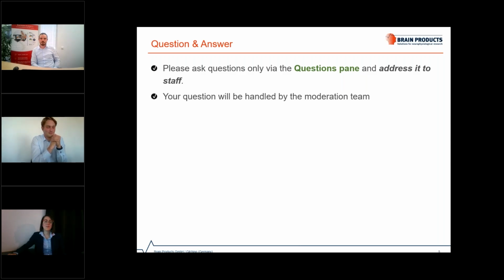Thank you for the answer, Eduardo. There's another question. Is your equipment licensed for clinical or medical applications? No, as a mission of our company, we focus on research applications. We want to design products that are flexible, modular, expandable, that can be combined and integrated with different types of devices.